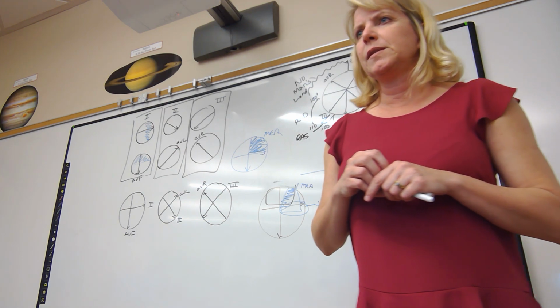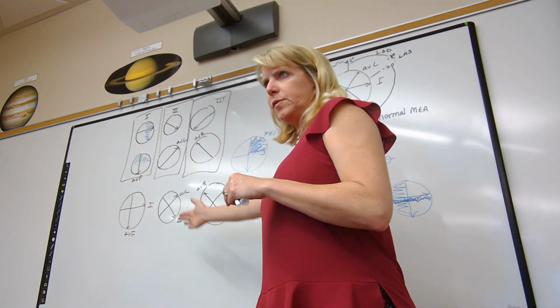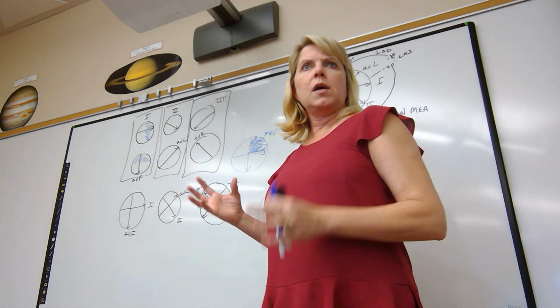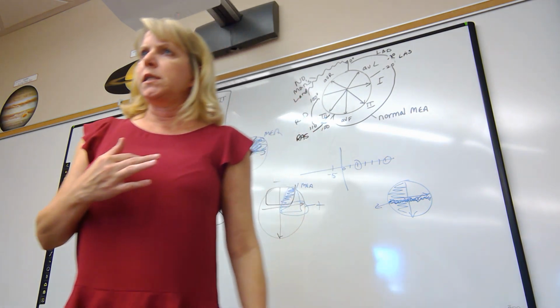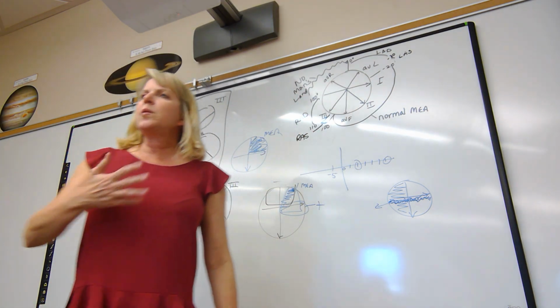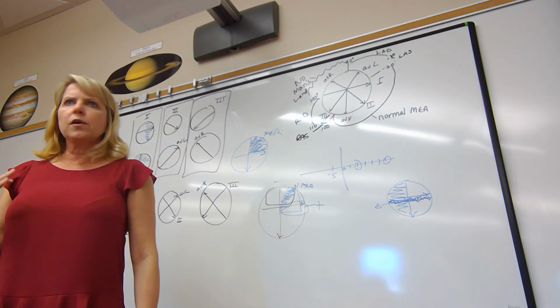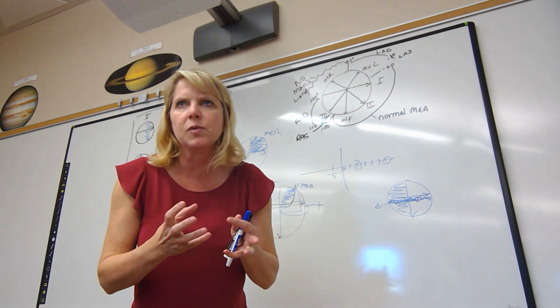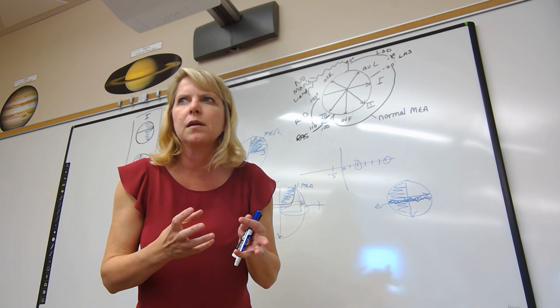Okay? So if you play with these 3 potential leads scenarios, an RAD or an LAD, when would it be an upward deflection or a down? There are only so many finite possibilities. Do you see that?